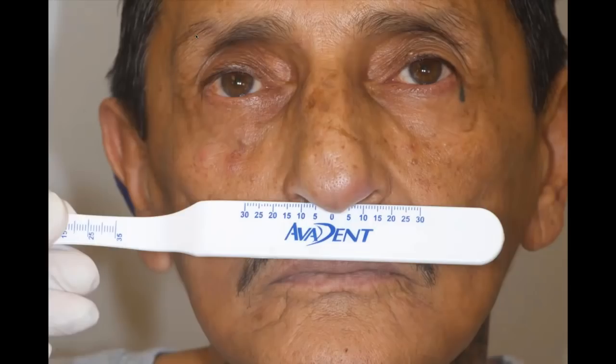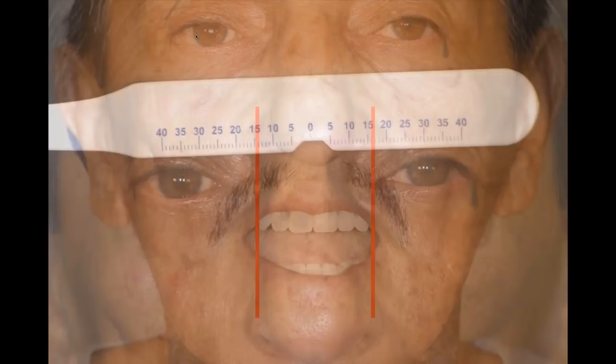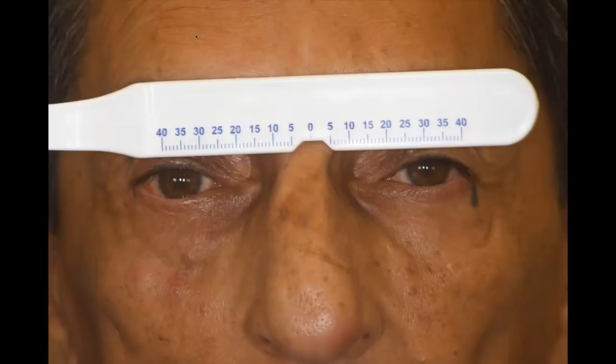The second thing we do is take a measurement for the width of the nose — this gives your designers a sense of where the canine should be positioned in the denture. Next, take a measurement between the pupils of the eyes and record that. This will be used to determine teeth size, but not in the way traditionally taught in school. There was a belief that there was a correlation between pupils and the size of the central incisors — that's not true. We're going to use this measurement in a different way.